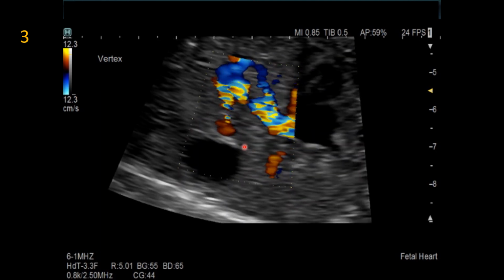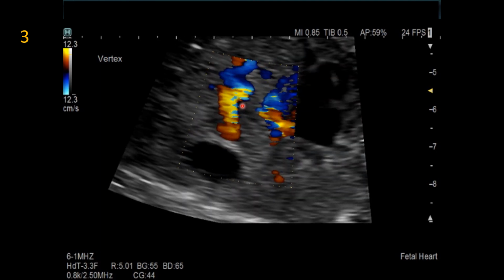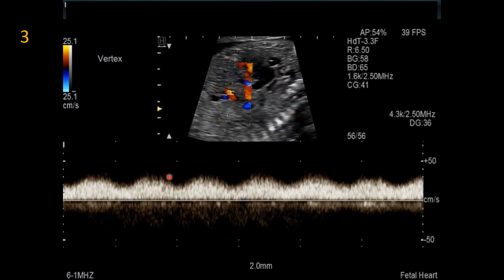And a little bit closer look at that. Here it is coming into the portal vein. There's the ductus venosus there. And so when we interrogate that, we have this relatively high velocity phasic flow, which postnatally the ductus venosus will become constricted or close altogether, and this will be a very high velocity and obstructed pattern, putting the fetus at severe risk for decompensation.